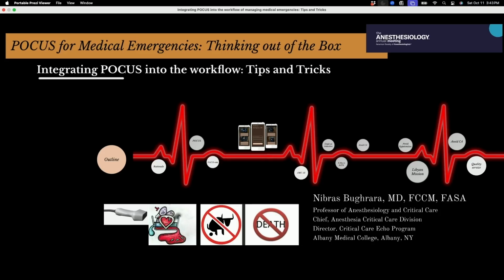While they're setting it up, if you take your POCUS machine with you, if it takes only 2 minutes or so to look at those views, I think it's doable in everyone, because it's hard to say. The scenarios can be the same, but what you might see might be different, right? So I don't think we can selectively say that I want to scan this one and not this one.